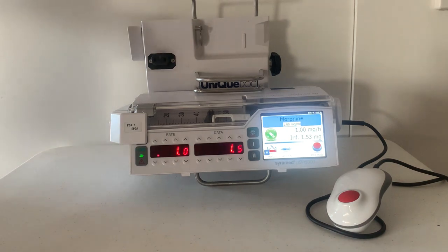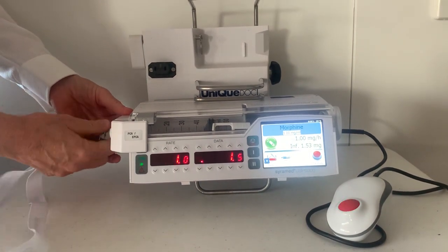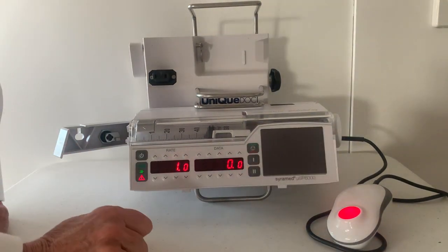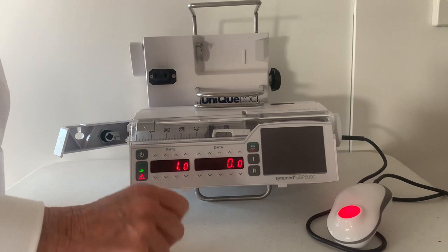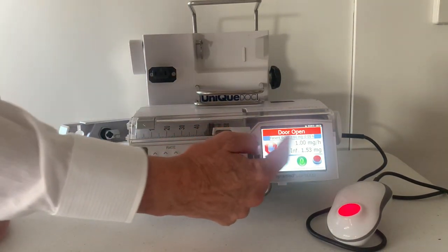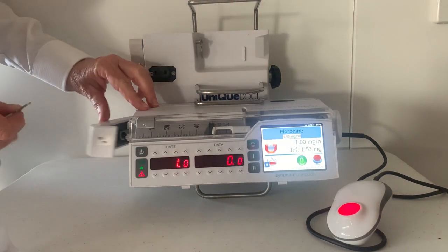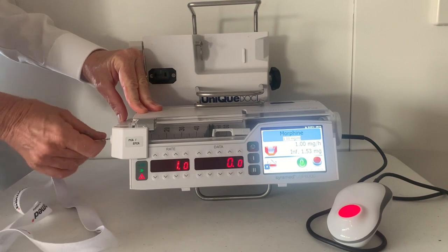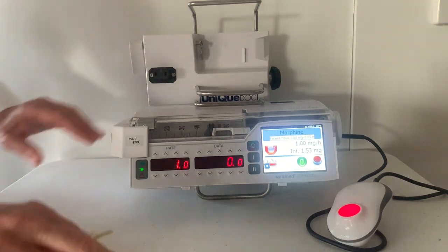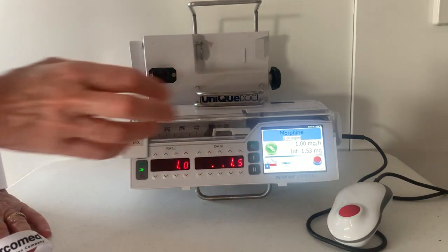The Syramed PCA has many alarms. I'm now going to demonstrate the open door alarm. Note that there's an audible and a visual alarm. To silence, press the bell. The visual alarm will continue until the problem is resolved. Then restart the pump.